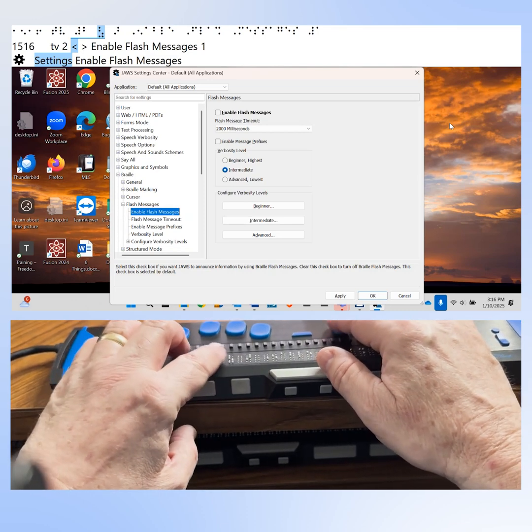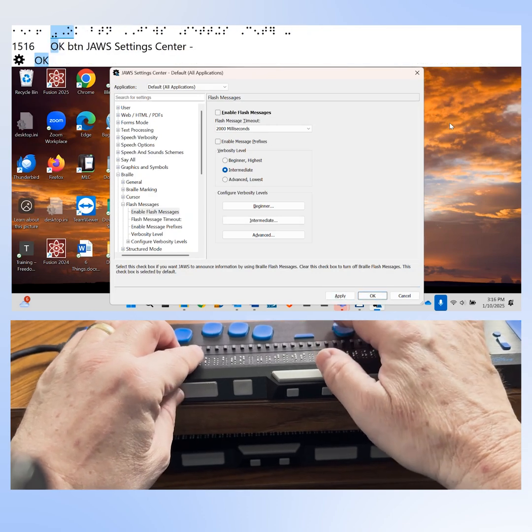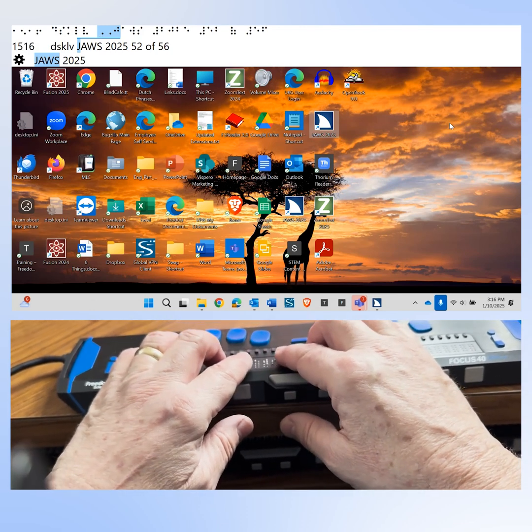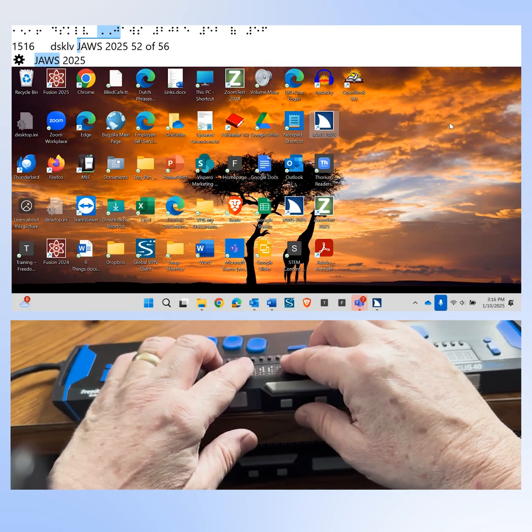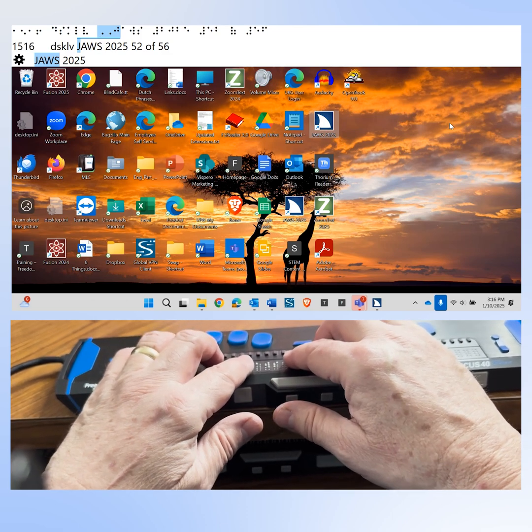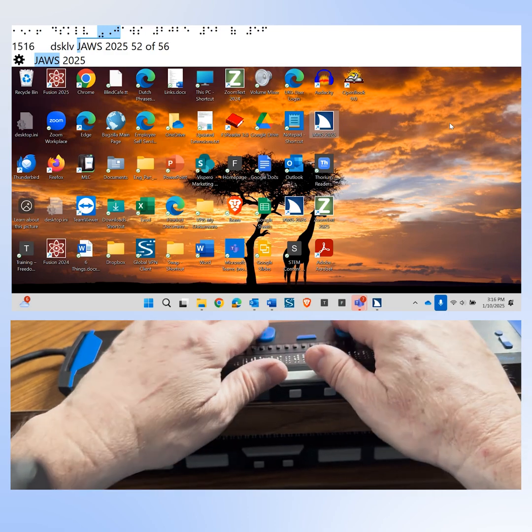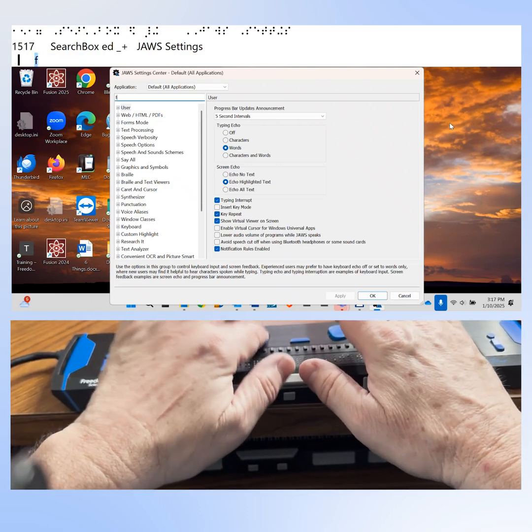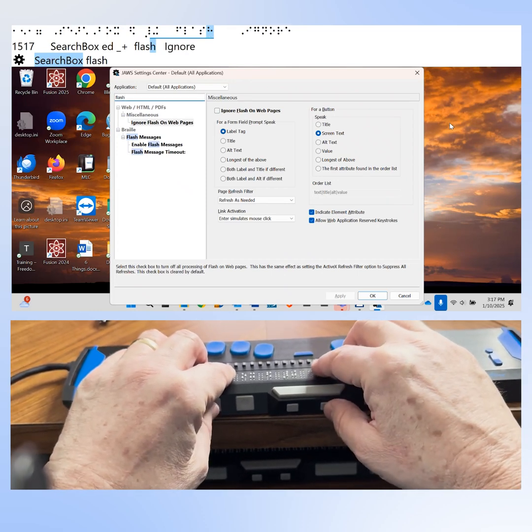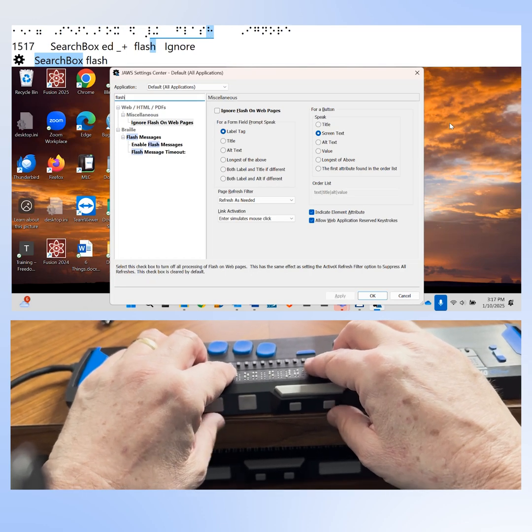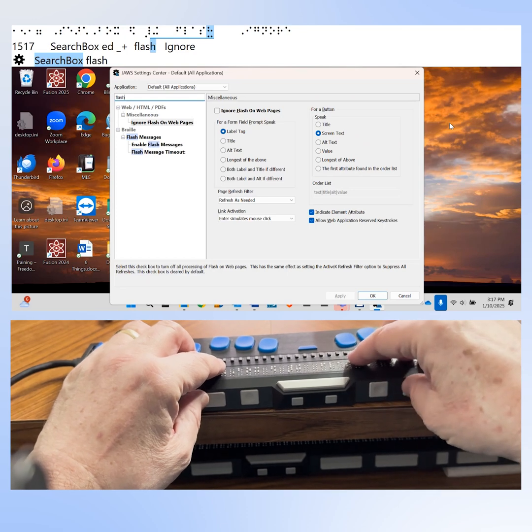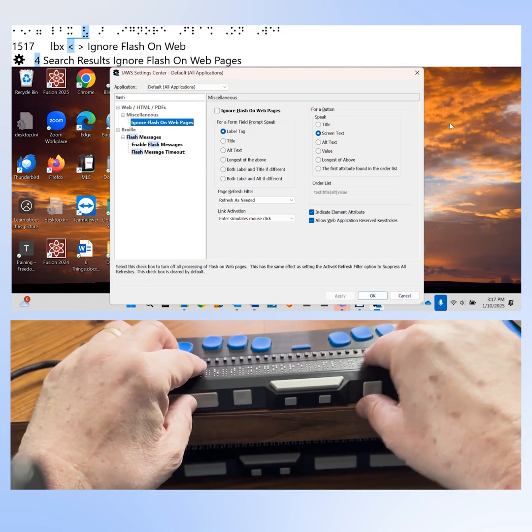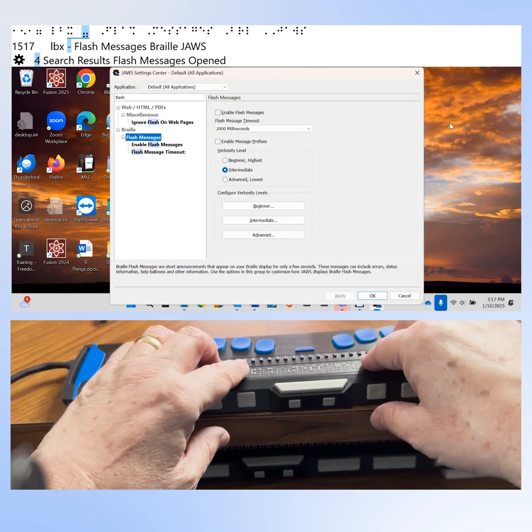Now I'm going to show you how to change verbosity and duration of flash messages — that is, how long a message is displayed on your braille display. Go into Settings Center by pressing Insert Number 6. Enter "flash" into the search edit field to get four results. Use the rocker bar to arrow down to "Flash messages" under Braille, then press Enter to move focus to that part of the tree view. The Flash Messages branch is closed — press right arrow to open it showing five items.